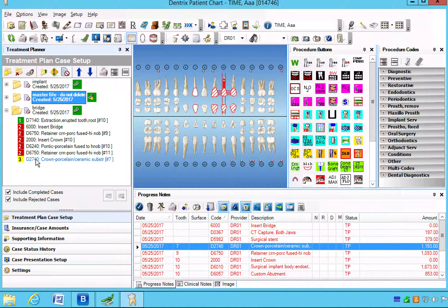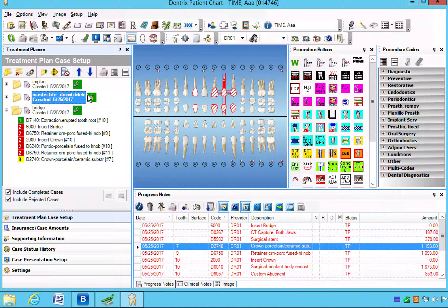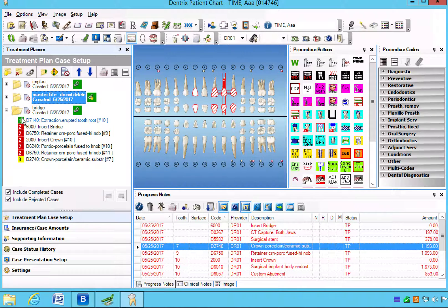And we'll open that up to verify. One, two, and three show up again. Now if you forget to number this first, you're going to have to go in and number each one individually. So by numbering everything in the master file before you create the alternative, these numbers automatically carry over. So it's much easier to do that first.